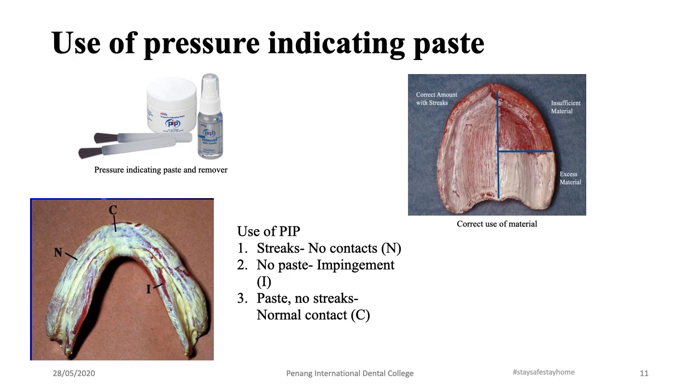And if you see that there is impingement, the entire paste would be dissipated from this area. You see that letter I on the figure, you see that the entire denture is being exposed. That is a place where you have impingement. So this is how you find out where exactly the pinching of the denture is taking place on the oral mucosa, and you trim that specific area.